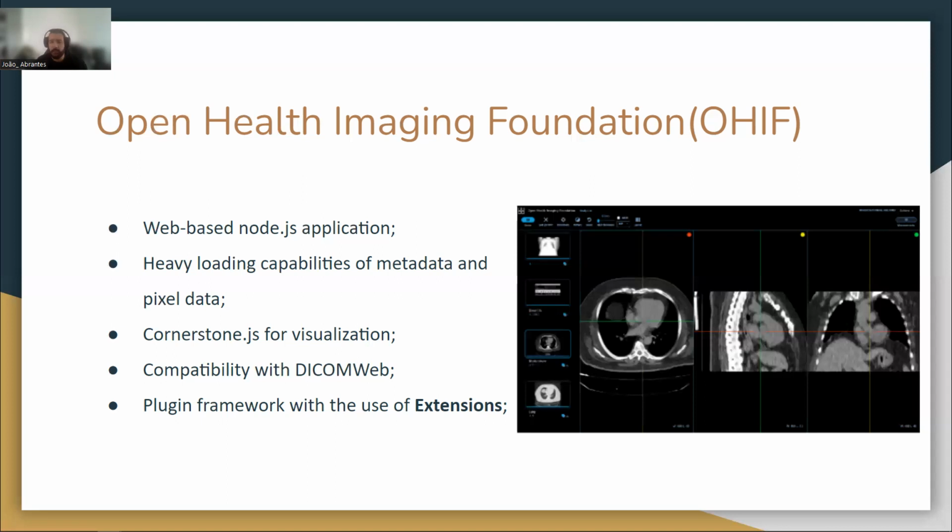It has extensive documentation and several guidelines on the development process. It is a fully web-based application with an extensive open source development community, with new features and extensions continuing to be released, and built to be extendable, adaptable, and customizable. We had that in mind. OHIF would be our viewer component, extended with the features required to integrate the external processing and analysis methods.